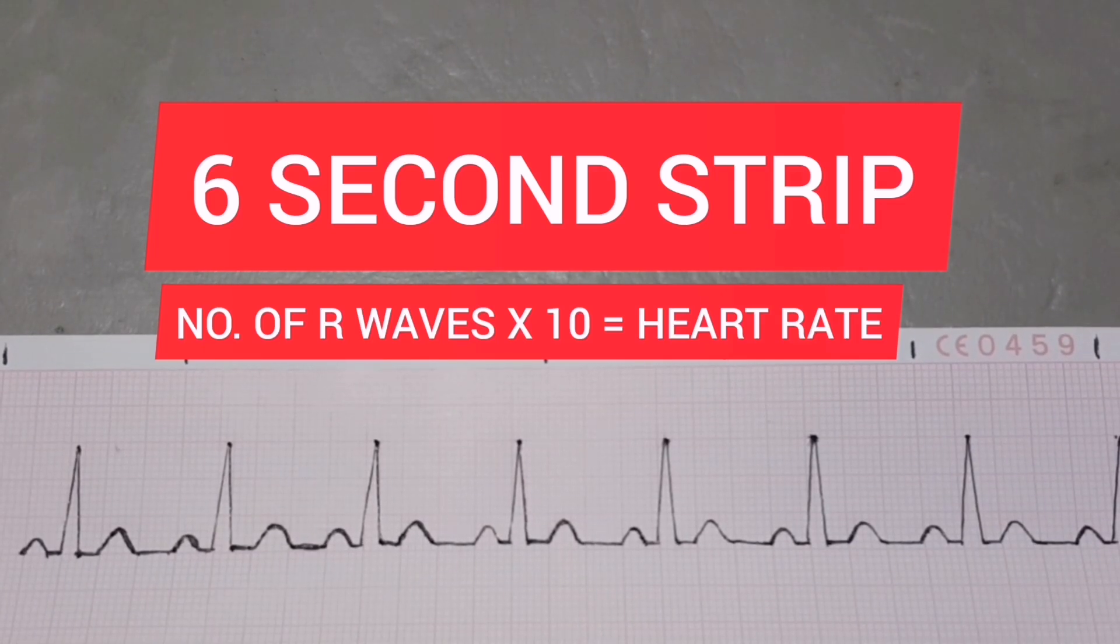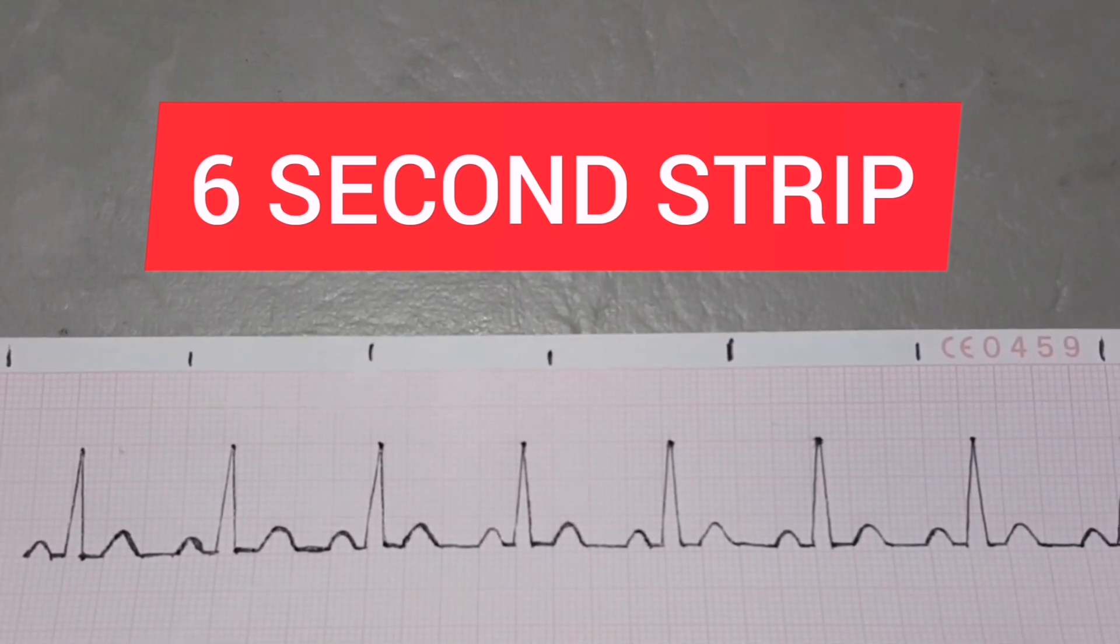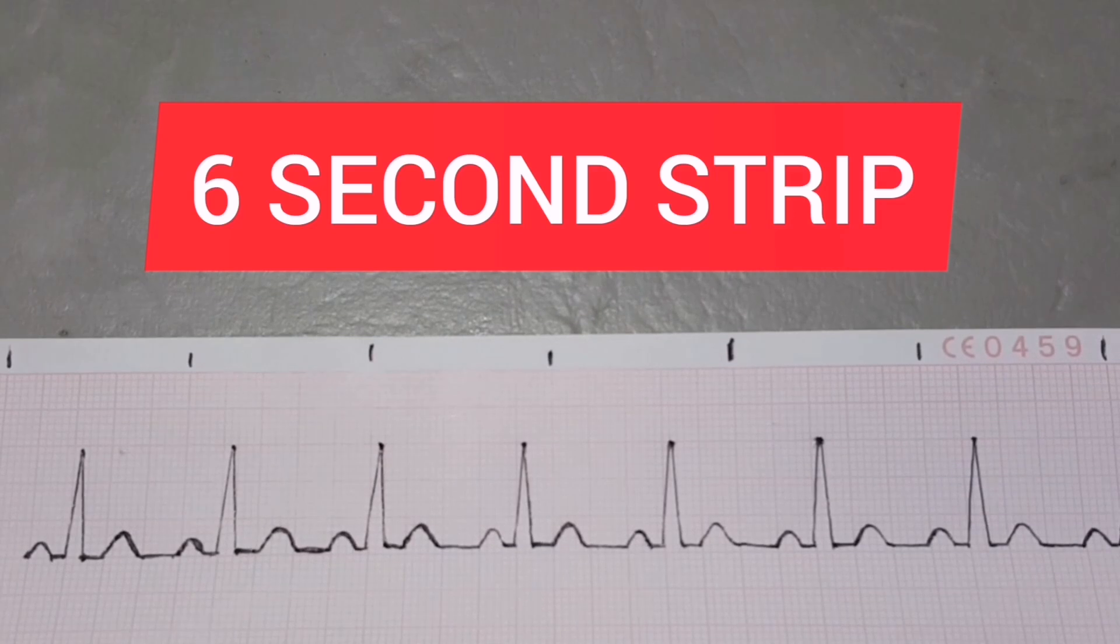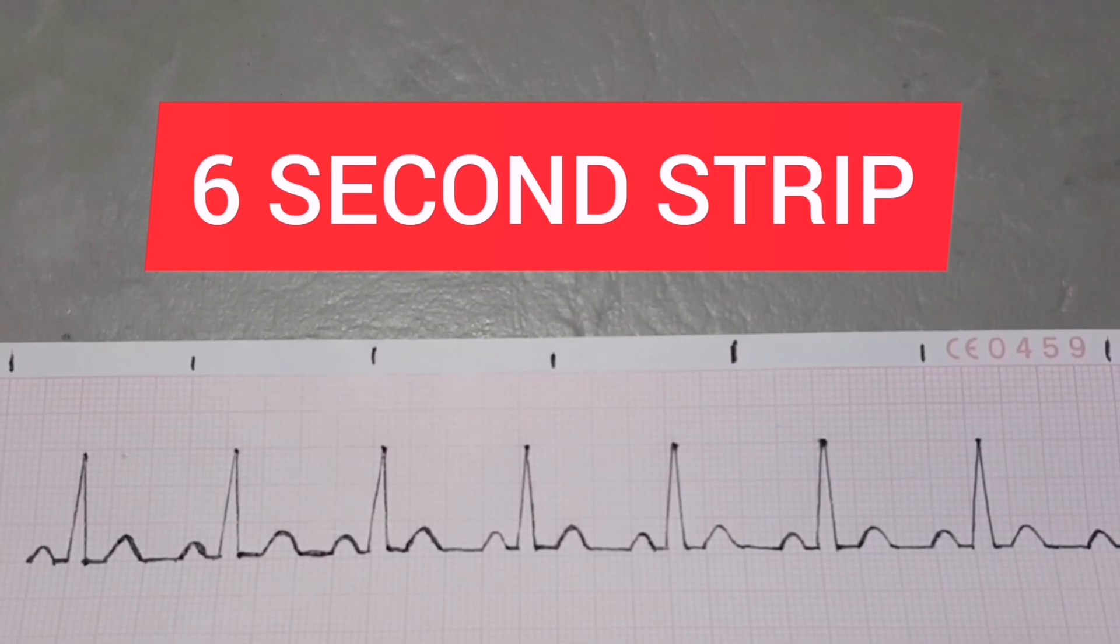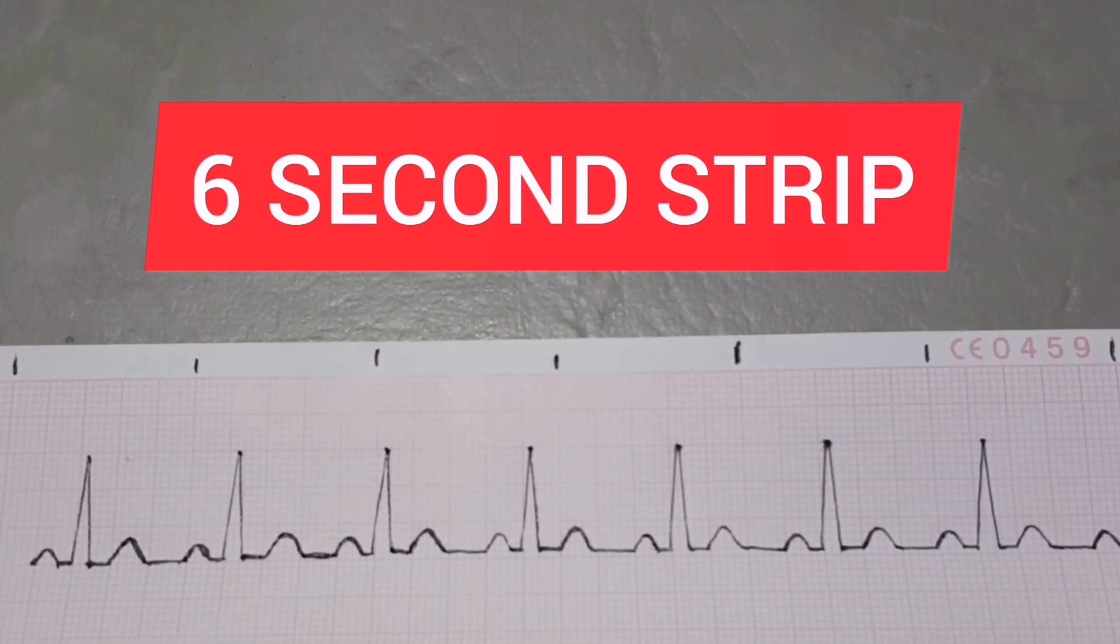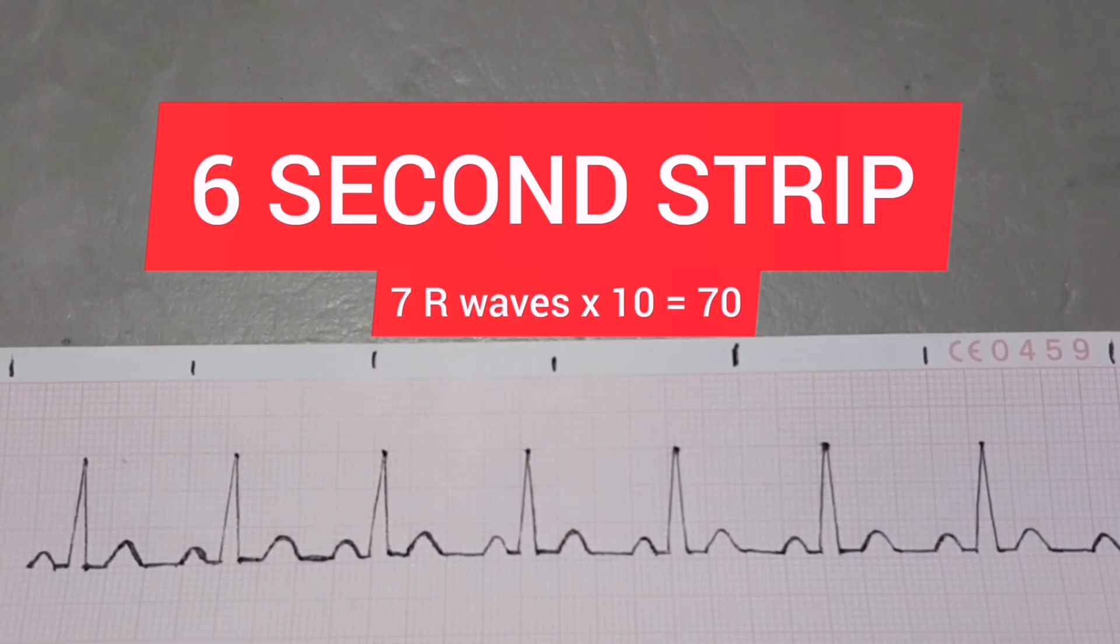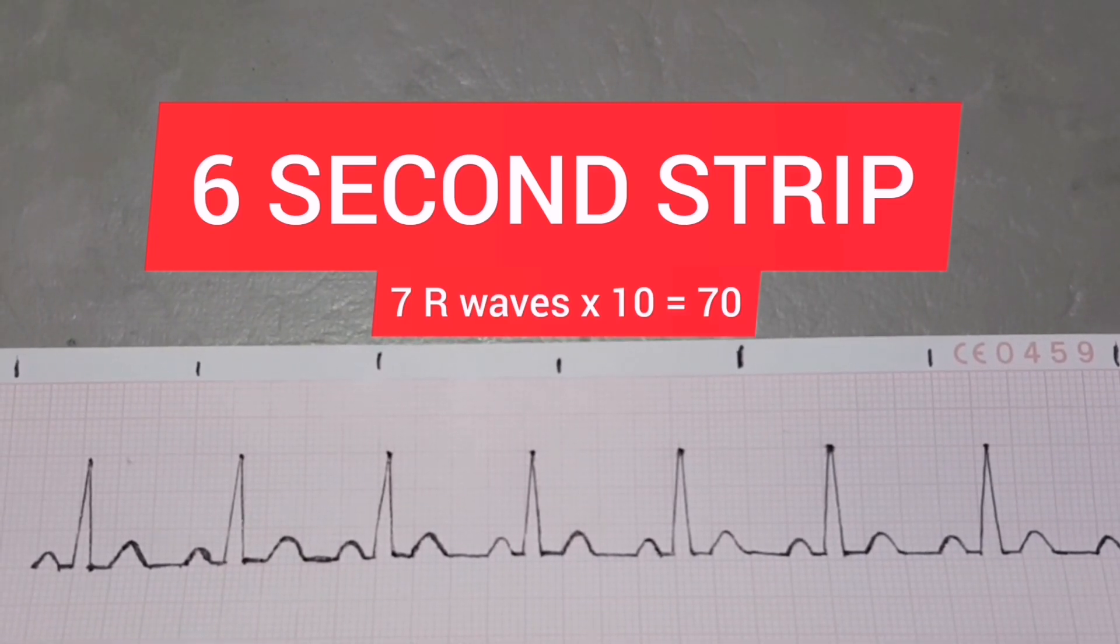Example, that strip is a six-second strip. And let's count the R-waves. 1, 2, 3, 4, 5, 6, 7. 7 times 10 is equal to 70. So heart rate is 70.